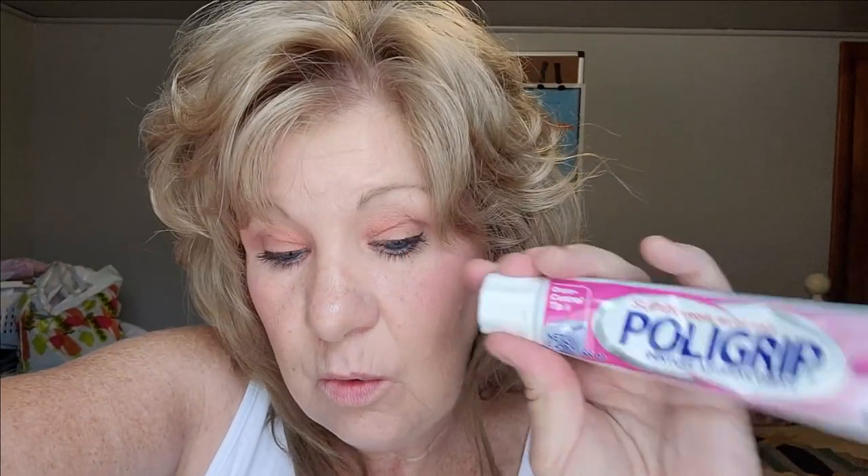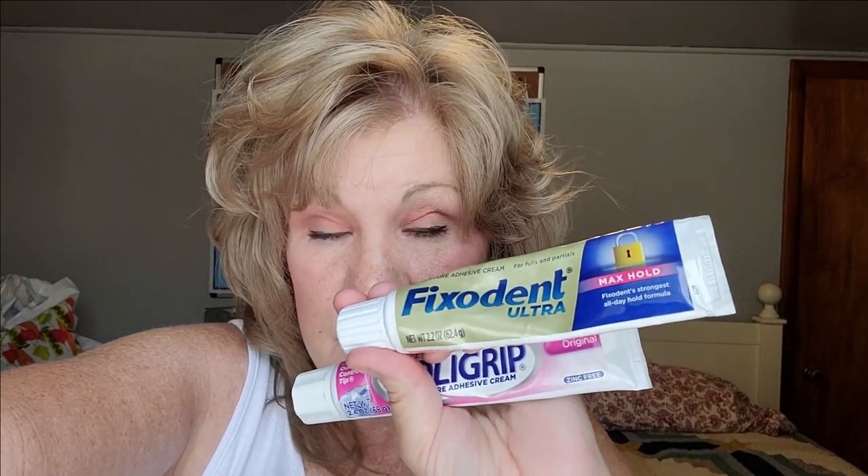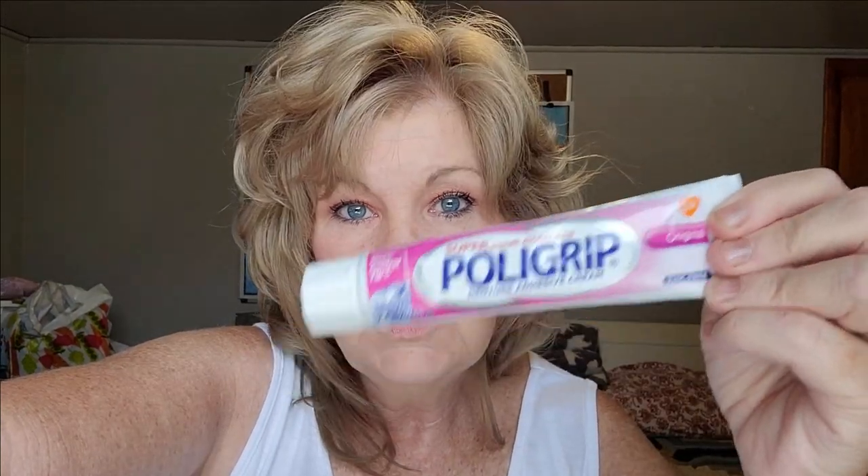I'll use this one — this one doesn't hold as good as the Fix-A-Dent Ultra. So if it's in the evening and I just need something to hold me for a couple of hours, I'll use this one. Not the Fix-A-Dent Ultra because it's like it glues into your mouth. And if you use it and want to take your teeth out in two hours, it's going to hurt because it pulls the skin on your gums. This one doesn't — I can use this and know I'll be able to take my teeth out without so much hurting.